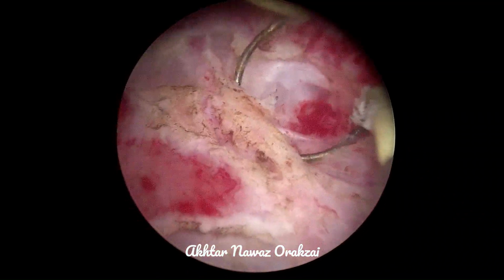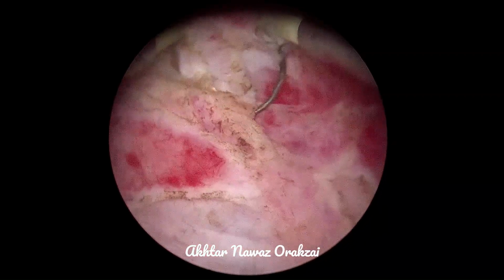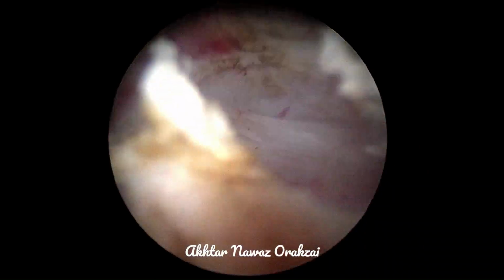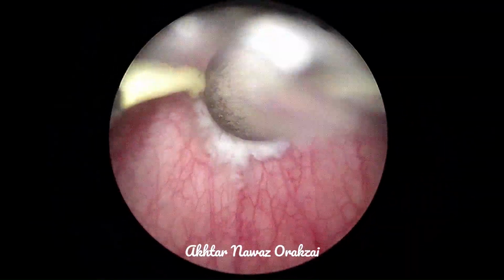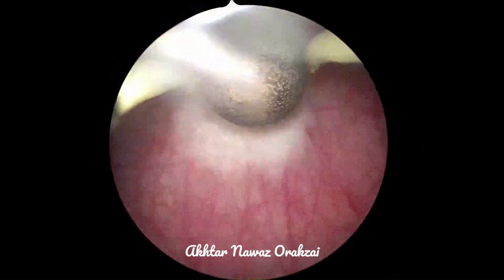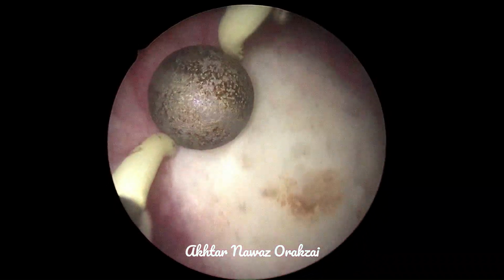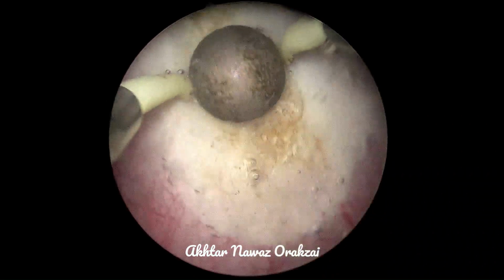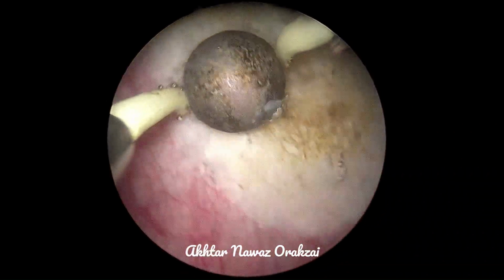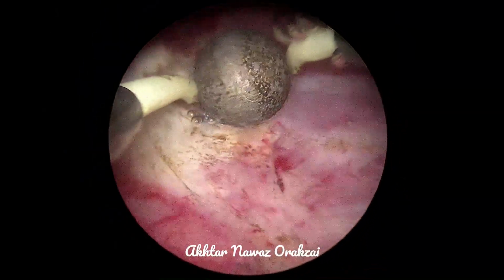Here I can see that already there are deeper portions in the resection. The muscle may be there. However, we take some bit of tissue from this side as well. And now we coagulate, as resection will be difficult, we coagulate and fulgurate this small papillary growth, which seems to be highly vascular and aggressive. And now we come and coagulate the area.